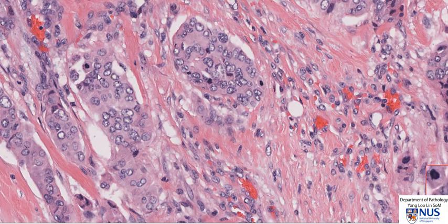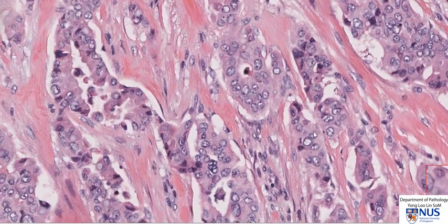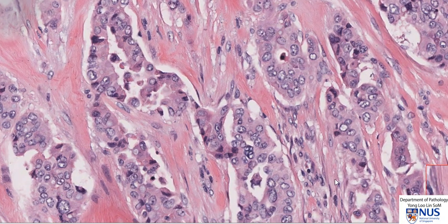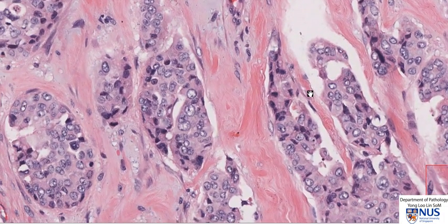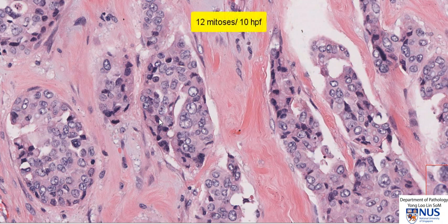For the third component, we count the number of mitoses in 10 consecutive high power fields. So there's one here, two, three, and four. Some figures I won't count as they are probably apoptotic. That's four in the first field. Moving to the next high power field, it's four in field two and five in field two. Moving to the next field — six in field three — and so on until completing 10 high power fields. In this particular case, it was 12 mitotic figures in 10 high power fields.